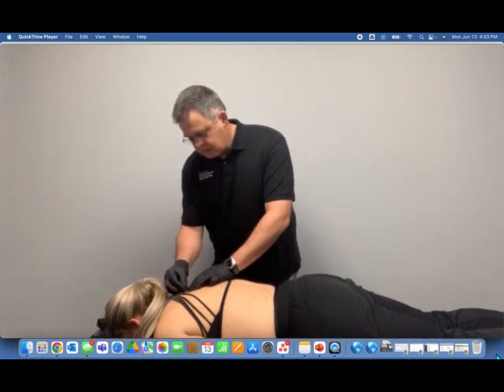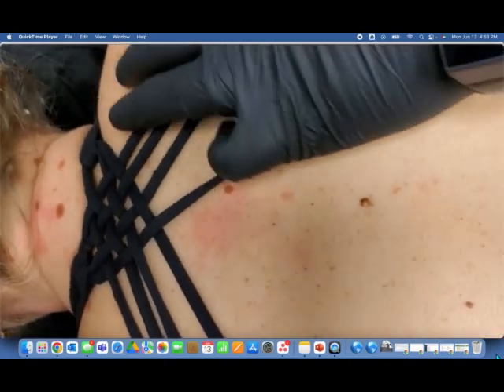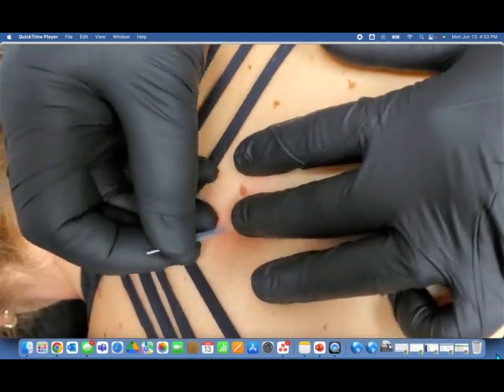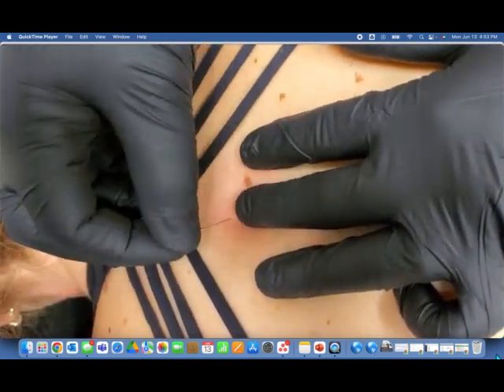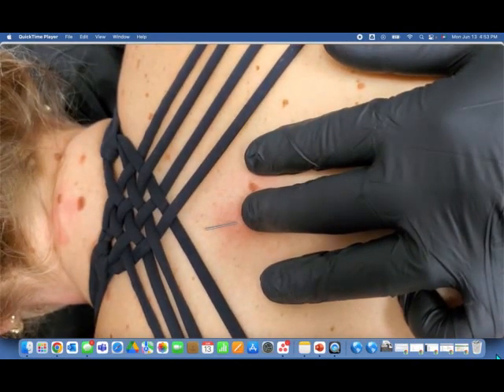Again, with this, because of the thoracic kyphosis, we're going to have a little bit different orientation when we're dealing with our 15 to 20 degree inferior angulation or caudal angulation, based on the position of the lamina.